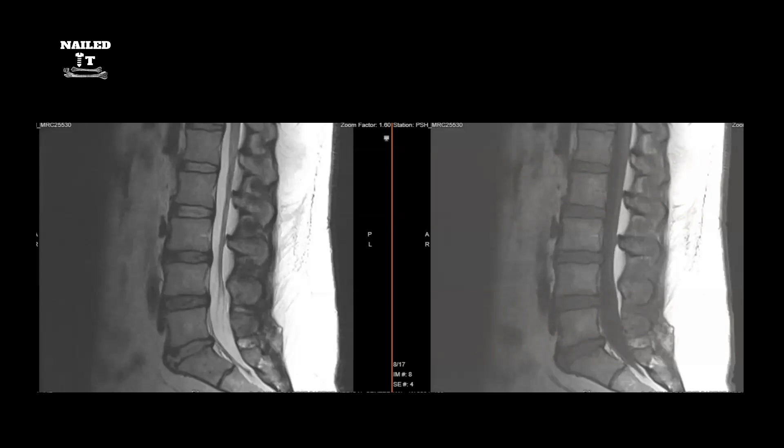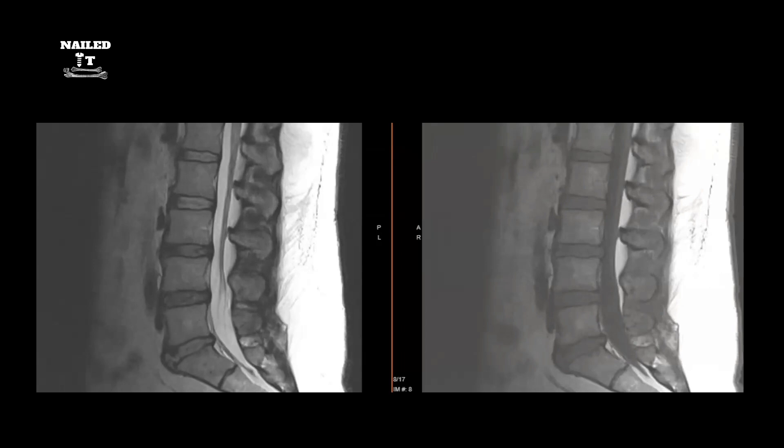We've got another good topic here — we're going to go over reading lumbar MRIs. We're going to cover the basics of reading these scans because they're pretty common, and I want you to have a good idea of what you're looking at once you see this in the clinical setting.